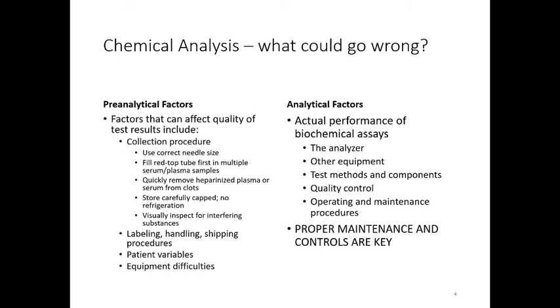If we're putting blood in those tubes first and mixing it, then those chemicals can get on the needle. And then when we put it into a different tube, that chemical is still in there, and that can change the sample or the test that we get from the sample. So we do recommend that you fill the red top tube first, or if you're filling another tube, that you don't invert it so that you don't get a chemical on the needle.